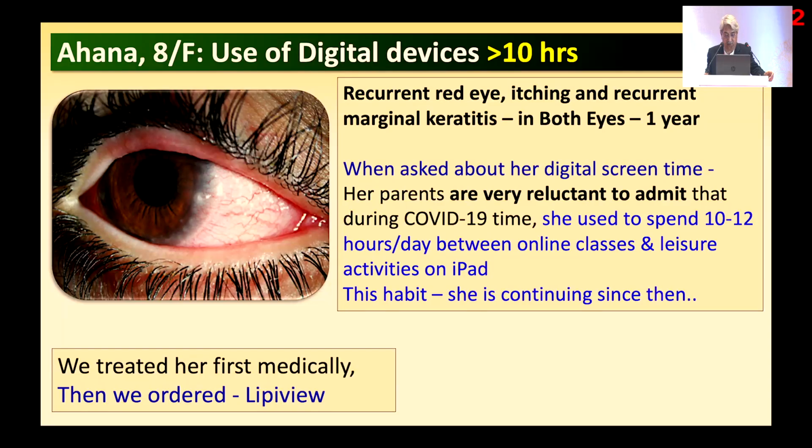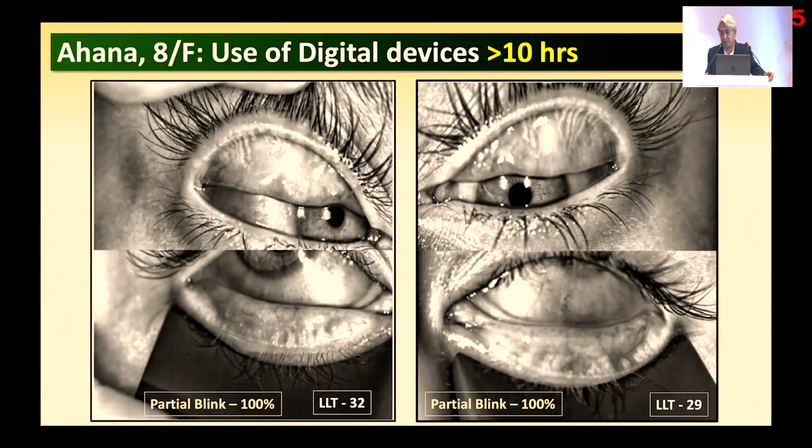We treated her first medically, then we ordered LipiView. And this is the LipiView picture of the 8-year-old girl. We were shocked to see this kind of meibomian gland. Virtually there are only a few glands left.